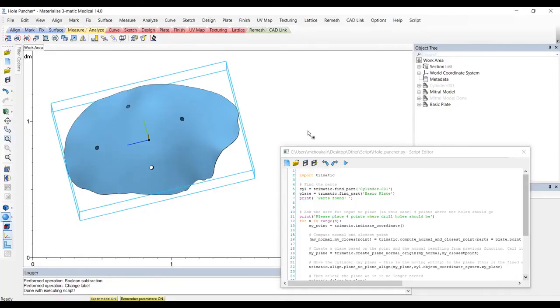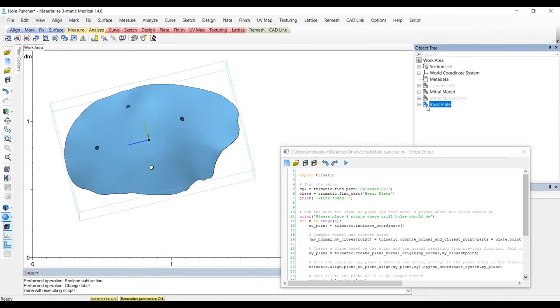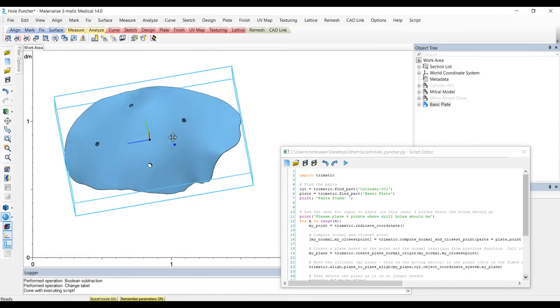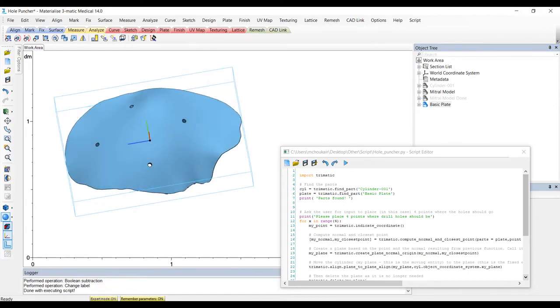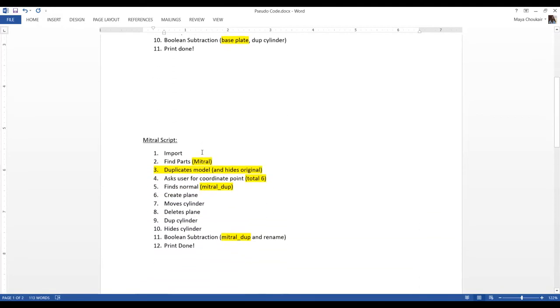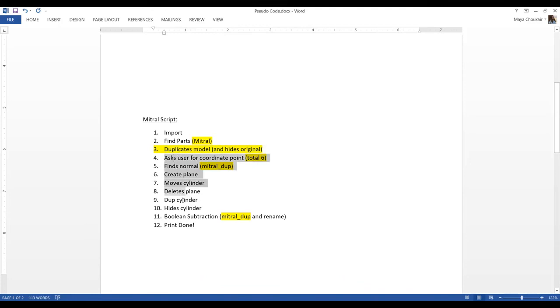And it looks like it did do what we were expecting. However, did you notice it didn't create a duplicate part, it kept the same name. For my application, I want to make sure I have an original just in case I want to go back before I created those holes. So let's make sure to add that step in our pseudocode. So here's our pseudocode for the mitral script. You'll see we'll have all of those changes. And I want to make that duplicate before we do any of these steps and work off of the duplicate model.